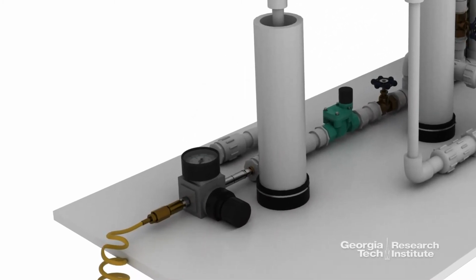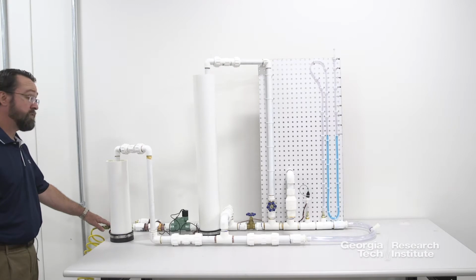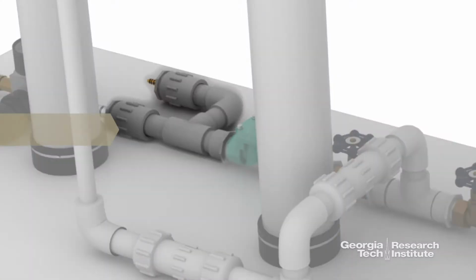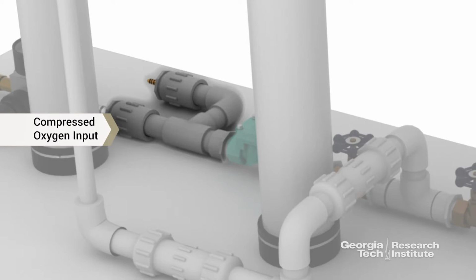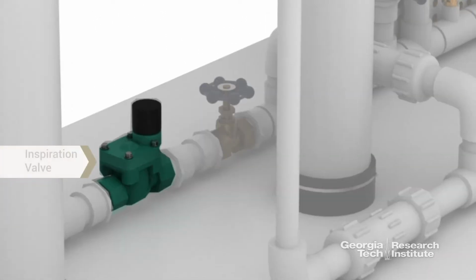All right, the first component in the ventilator is a pressure regulator. So we set the pressure regulator to 15 psi. Then we also have an input for compressed oxygen if that's necessary. So the two gases are combined and go to the inspiration valve. In this case, the inspiration valve is an off-the-shelf irrigation valve from Home Depot.